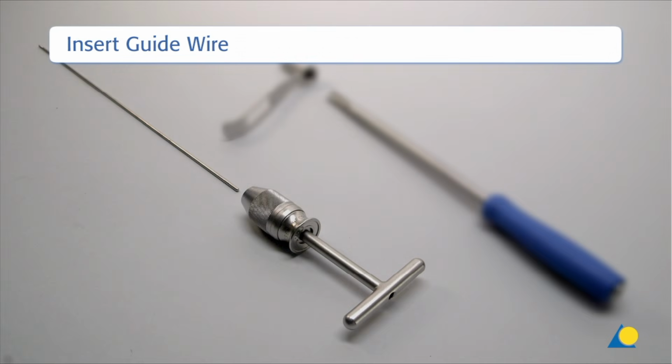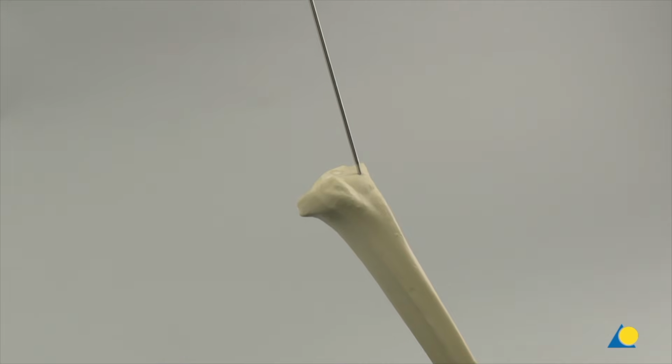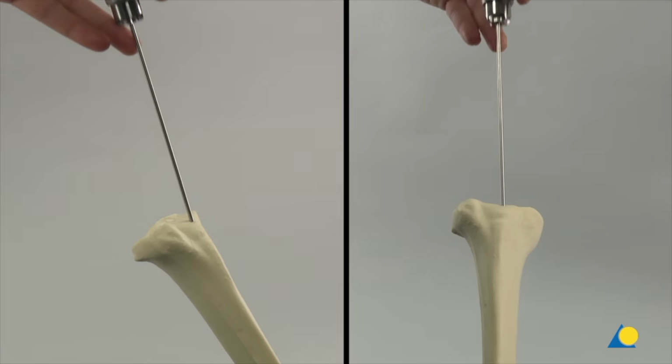The instruments used to insert the guide wire are the guide wire, 3.2 mm diameter, and the universal chuck with T-handle. The guide wire is secured in the chuck. The insertion point is slightly punch-marked at a 10-degree angle to the shaft axis in the lateral view. The guide wire is inserted approximately 8 to 10 centimeters, and its position is checked under image intensification in the AP and lateral views.